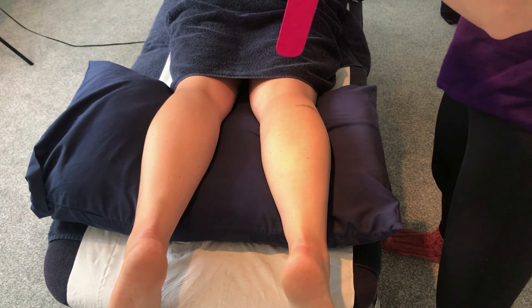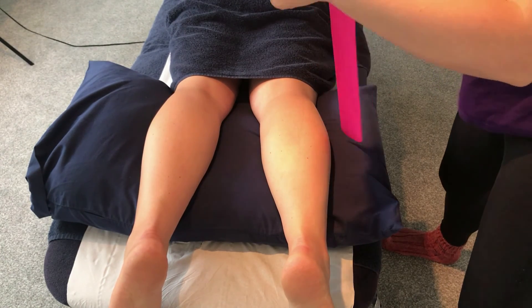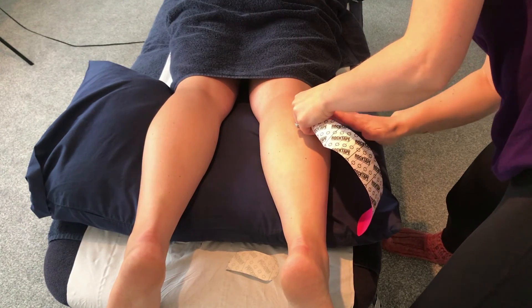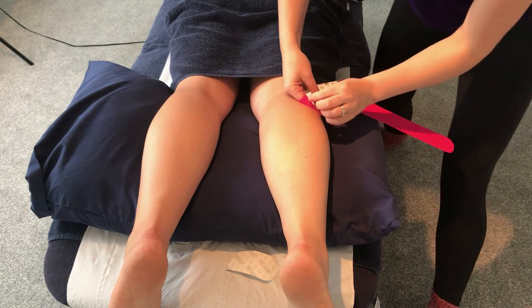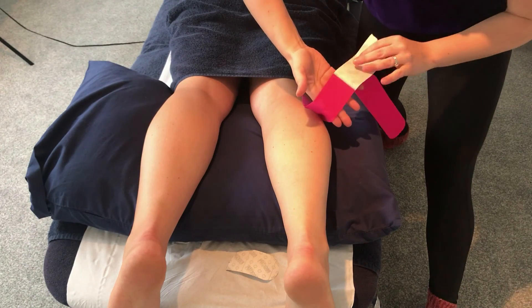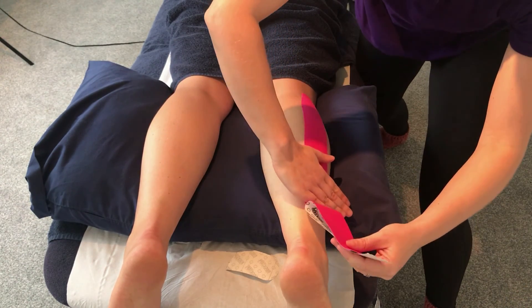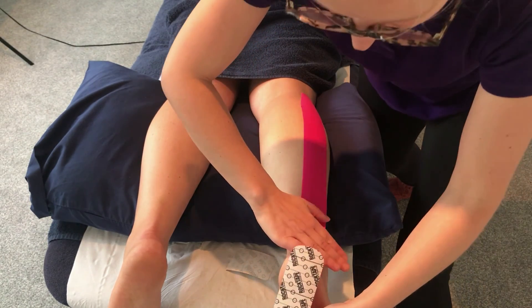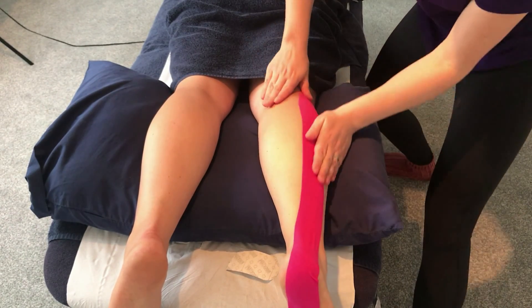For activation taping, we start at the distal end working towards the proximal end. Create the anchor on relaxed tissue first and stick it down. Work on the lateral side again as before — taking the back off the tape, taking the tissue into a stretch, with light tension on the tape along the muscle belly. Then relax the foot as the tape goes over the calcaneus, and rub it down to stick.